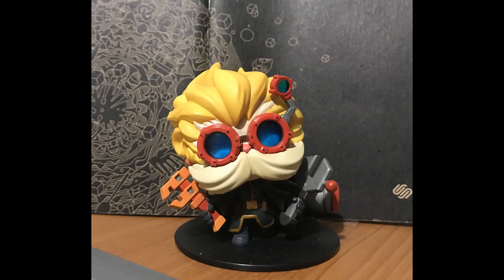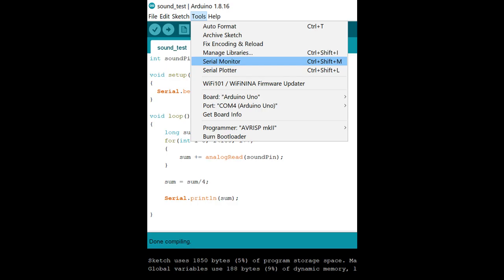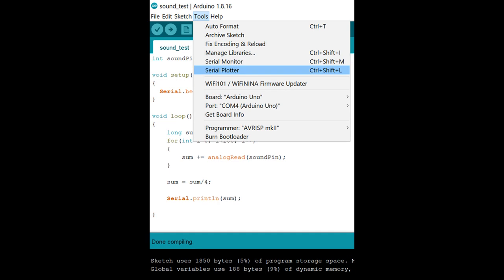If you see an error message when you try to compile or upload, make sure your Arduino is connected and assigned to the right COM port. If that is okay, then go over your software and check that everything is in the right place for the hardware connection, mic and pin and voltage and everything. After everything is good, you can go to Tools and open Serial Monitor, and you will see all the numbers going really fast. If you want to see the plot, do the same thing. Go to Tools and click Serial Plotter.